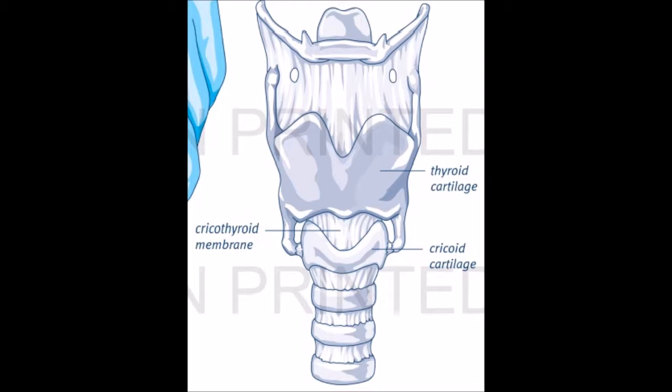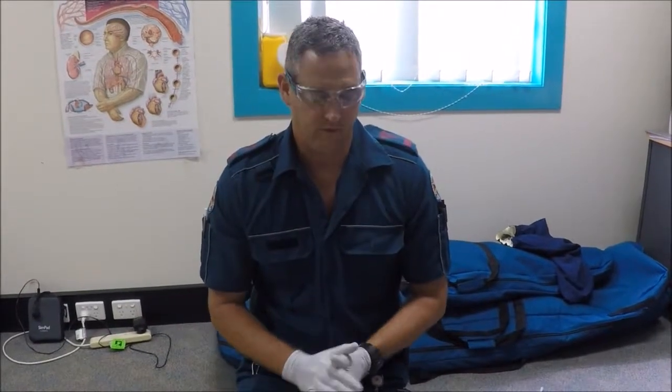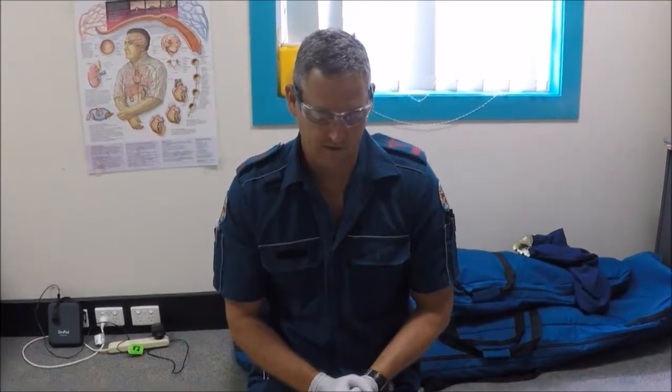Some considerations to be given when performing a surgical cricothyroidotomy: the patient must be very well oxygenated prior to the procedure, and there is significant potential for hemorrhage, so suction and extra hands with padding to absorb any hemorrhage should be on hand. So obviously wearing PPE, given that one thing I've taken away from some of the FoamEd podcasts is that you will get blood, no matter whether you're left or right handed, just because of the amount of vascularity, you will have blood in the actual procedure.